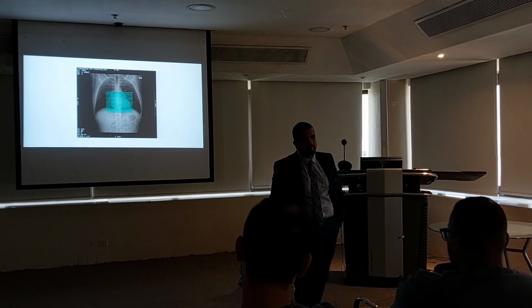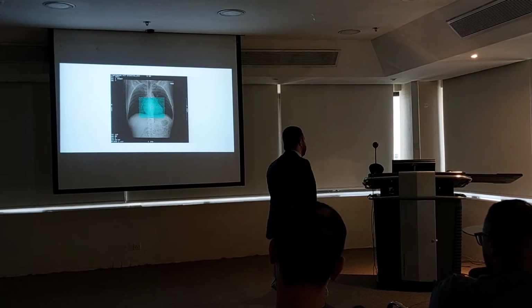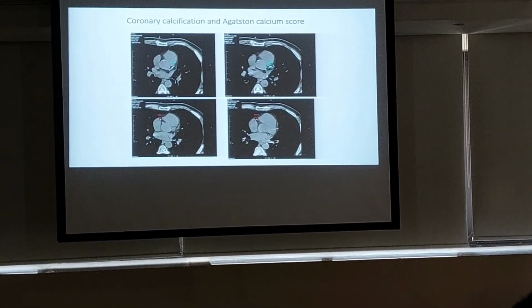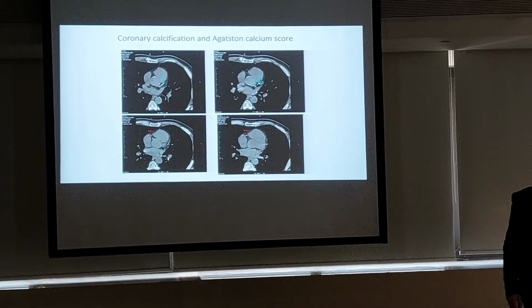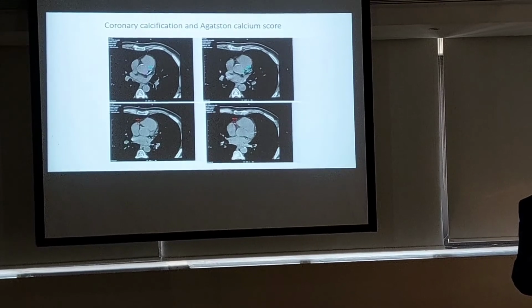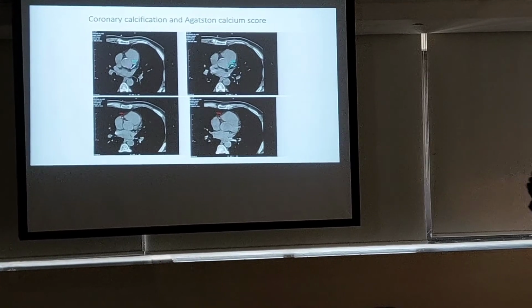That's why, okay? As soon as we have the images, we will start with measuring calcium, and then we will do the anatomy, because we know now where the coronaries are, so I make sure I'm covering the anatomy well, because I have to do that. And this is a gated study.